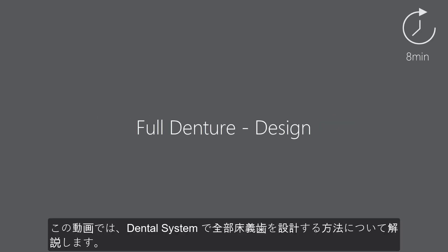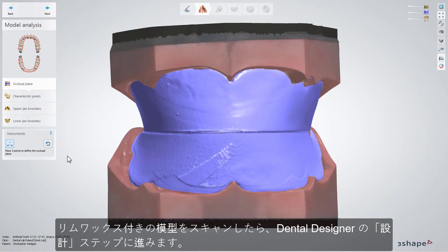In this video you will learn how to design a full denture in Dental System. After you have scanned the models with the wax rim, you will move to the design step in Dental Designer.